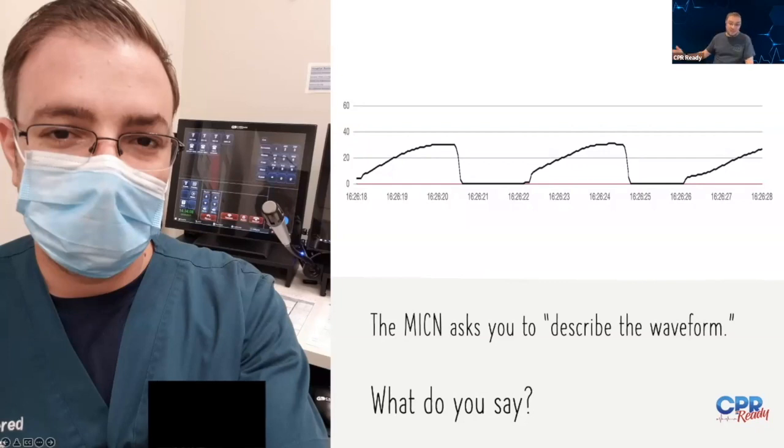The MICN, myself in this case, asks the medic over the phone, who says they have their patient on capnography who's having respiratory distress, to describe the waveform. That's a question we often ask our medics. And I'll tell you, almost without fail, the answer I get is "good." So don't answer right now. Some of you already know the answer, maybe most of you do, but looking at this waveform, think about how you would actually describe it if you were asked to.